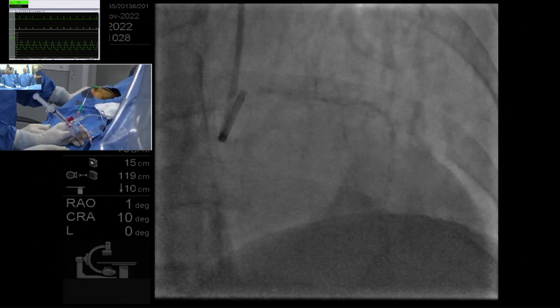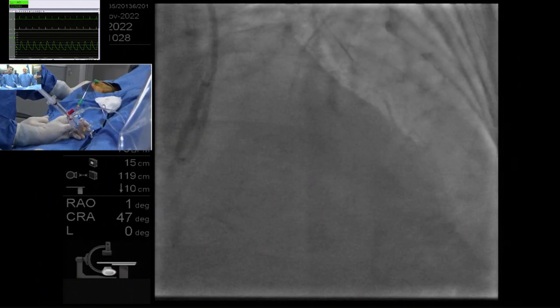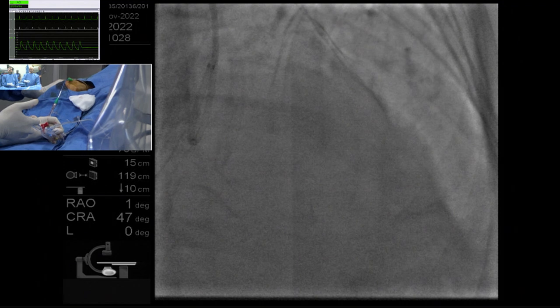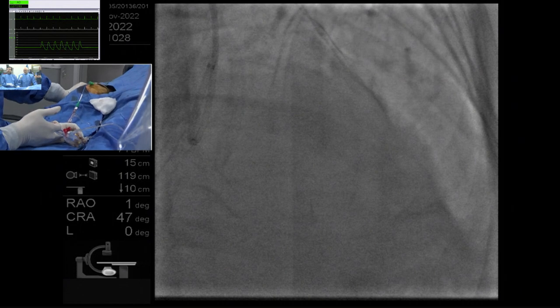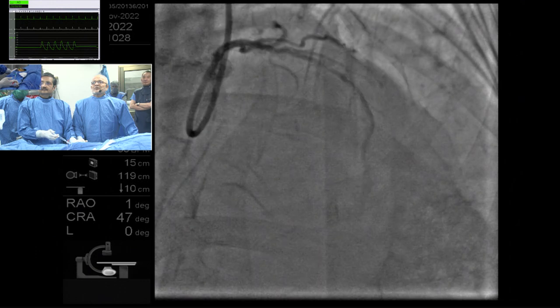So I see, Tejas, that you are now back with 6 French. The other 2 cases were done with 7 French, now we're at 6 French. Yeah. The RCA I did, first one was 6 French, and LMCA bifurcation was 7, and this is 6 French. IVUS. Yeah. I am taking some views.